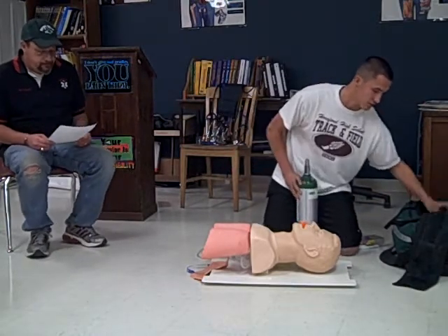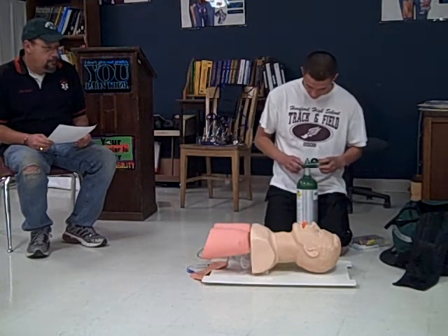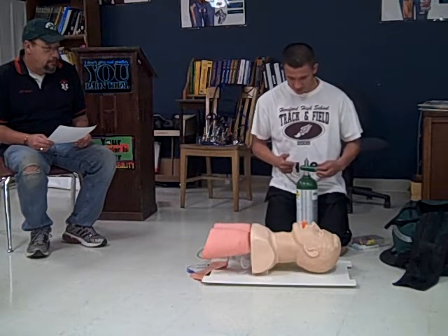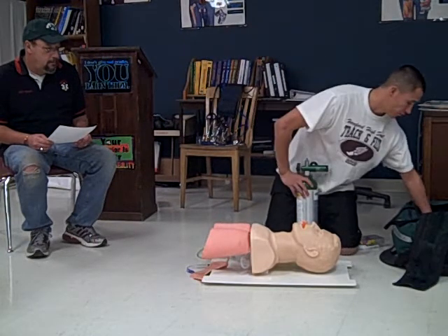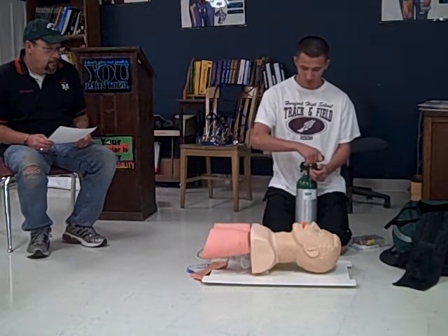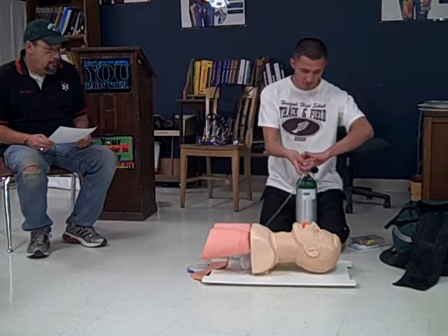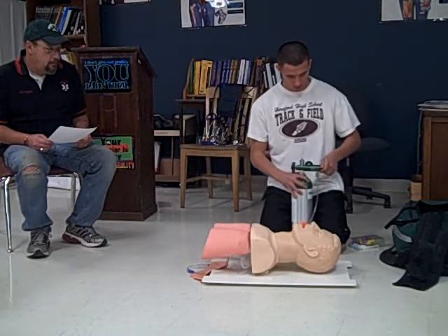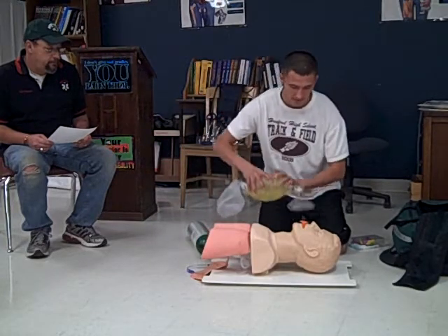Put the regulator on — just hand tight. Now I will open it and check for leaks. There are no leaks. I will put it on 15 liters.